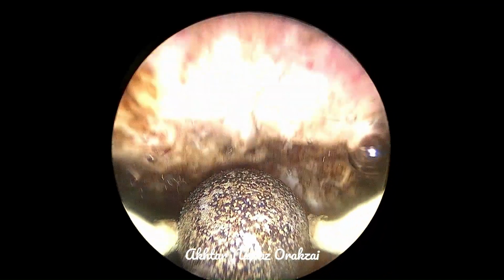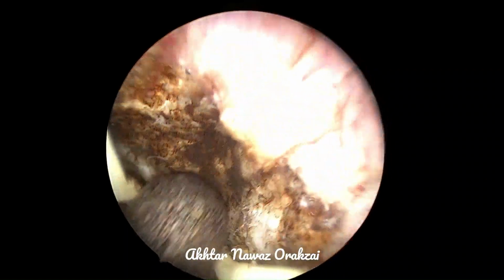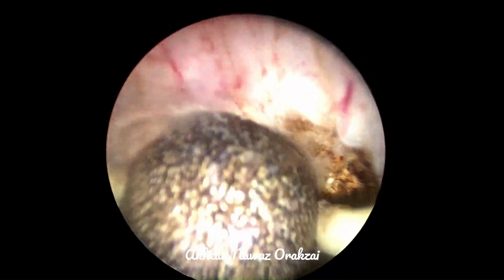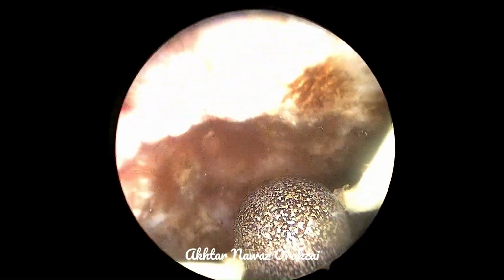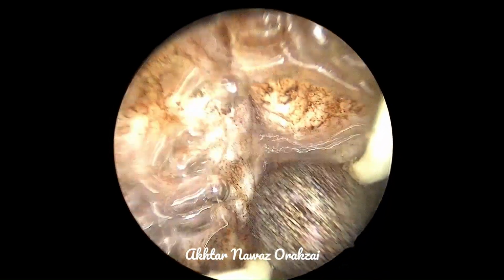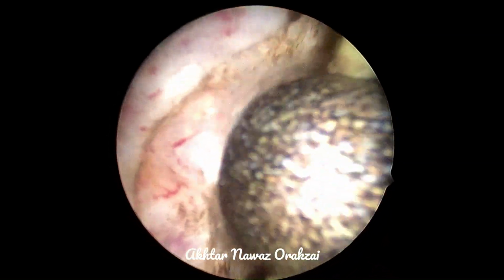Number two, excessive use of diathermy, I would say, can lead to bladder neck stenosis in the form of fibrosis. So only the active bleeders need to be coagulated.